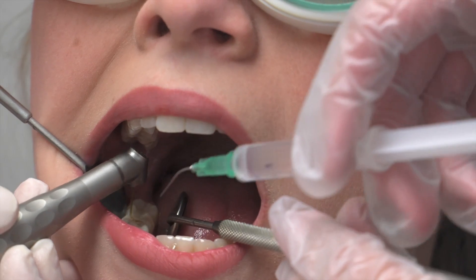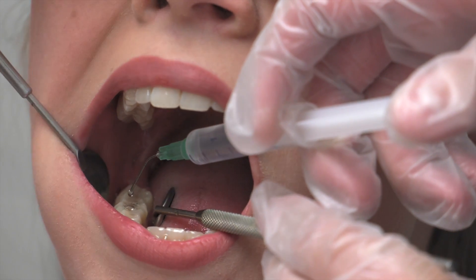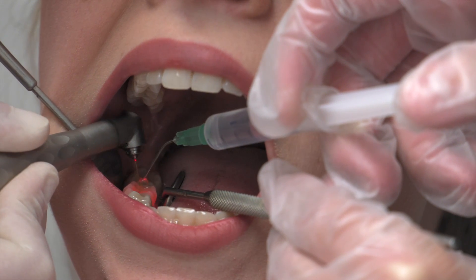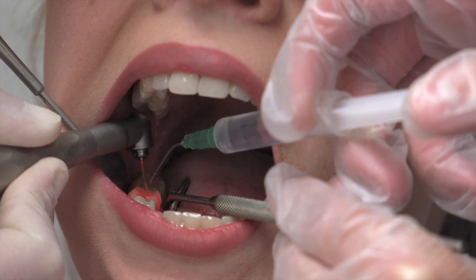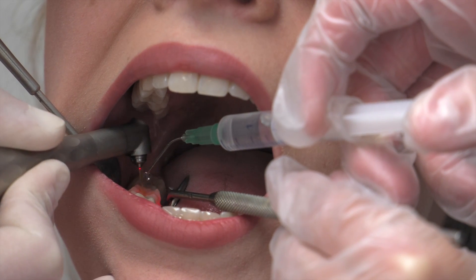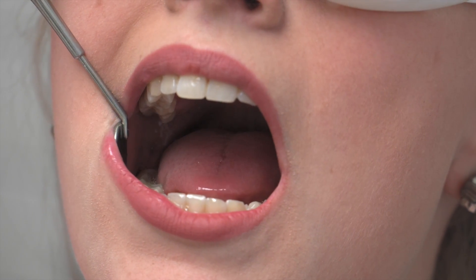Everyone is now wearing laser safety glasses and we start with the treatment. Jaco will do the rinsing and I am responsible for the laser. We are working with the Erbium YAG laser at a wavelength of 2940 nanometers, and the rinsing fluid is just ordinary water. Now we are finished with the rinsing and I'll show you a picture of the result.